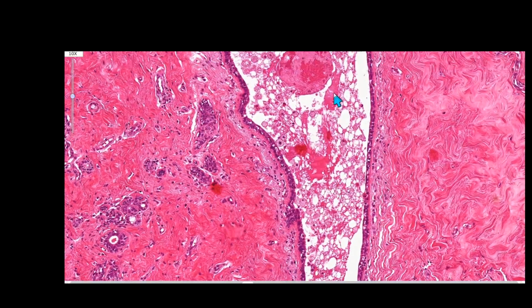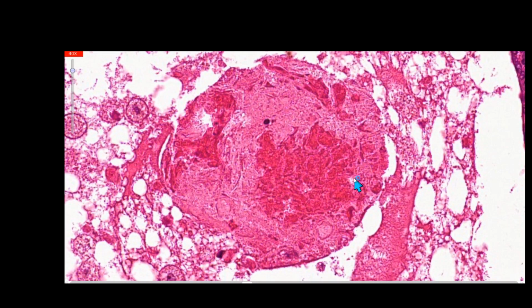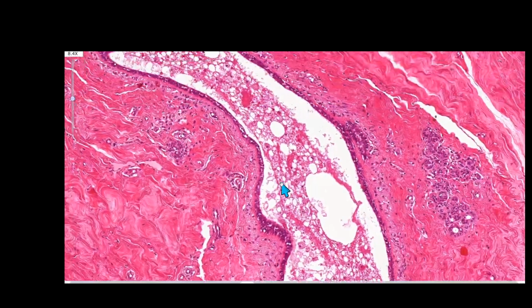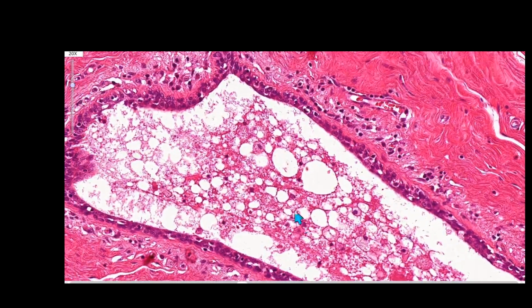Now we understand what is going on. In the fluid, which is viscous, getting more and more concentrated, these flat, concentrated proteinaceous materials are formed. The protein attracts to itself calcium. So now we understand how the flat stone-like, skipping stone-like calcification is formed. It takes a long time before these flat stone-like collections of proteinaceous material are formed. And as you see, the macrophages are guarding the events all the way to the end.